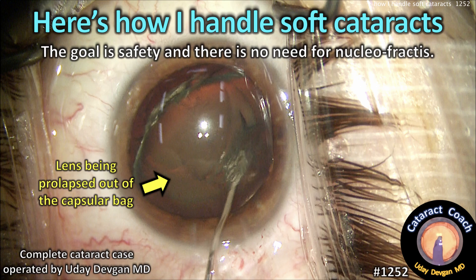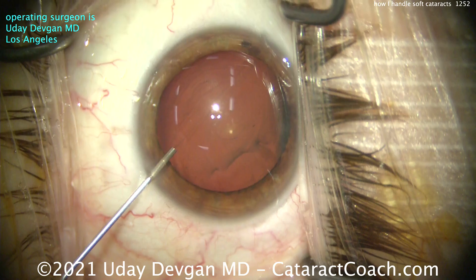Cataractcoach.com. Here's how I handle soft cataracts. My goal is safety and there really is no need for nucleofractis.